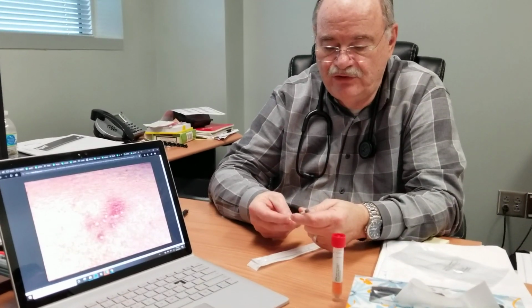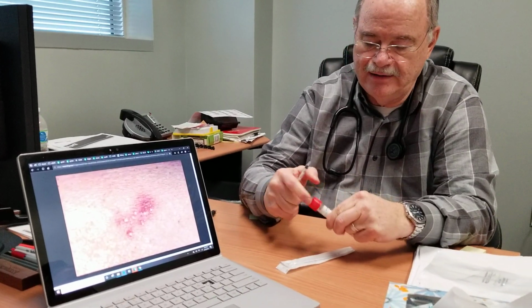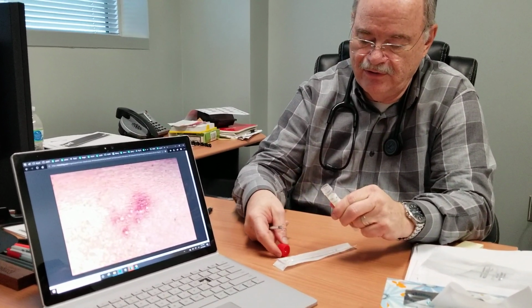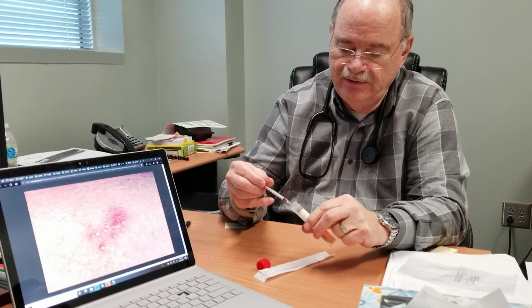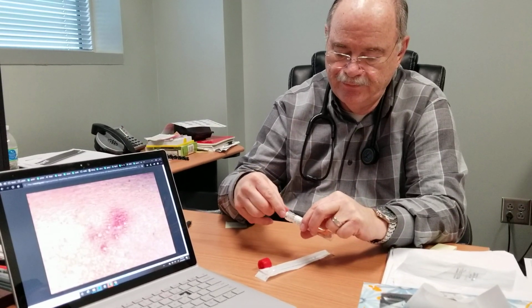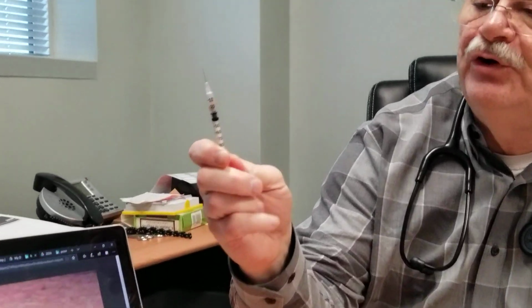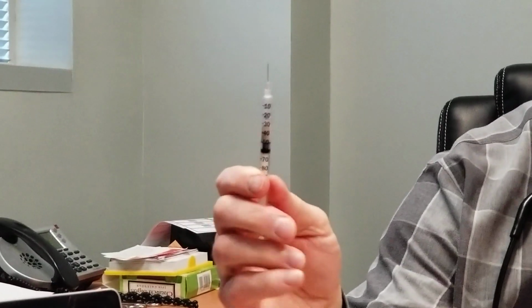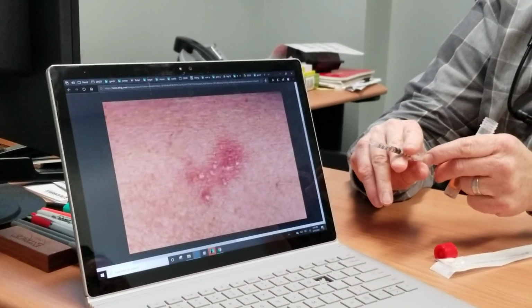So my suggestion is that prior to actually infiltrating this vesicle and draining it, you take your sterile syringe and you put it in the media and aspirate some of the media up into the syringe so that you have some liquid media. Then you back it off so that there's air in between, and then you can actually inject this into the vesicle and aspirate the lesion.